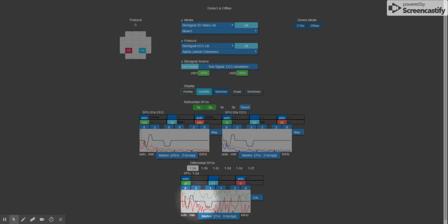We can see there's spiking in coherence, and indeed when those spikes in coherence coincide with the band that's being rewarded, then rewards will be generated. We'll wait for one to occur. Thus, we saw there it went green. That was a reward being generated.